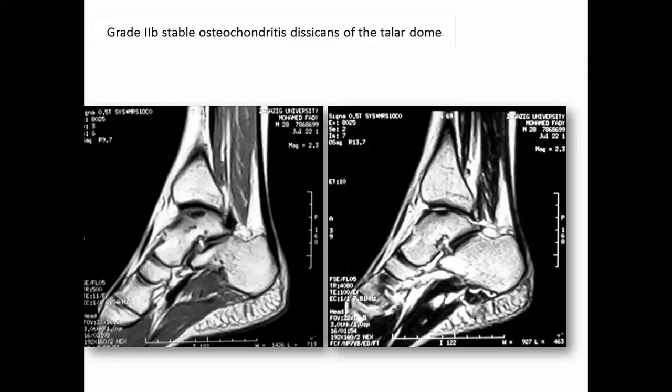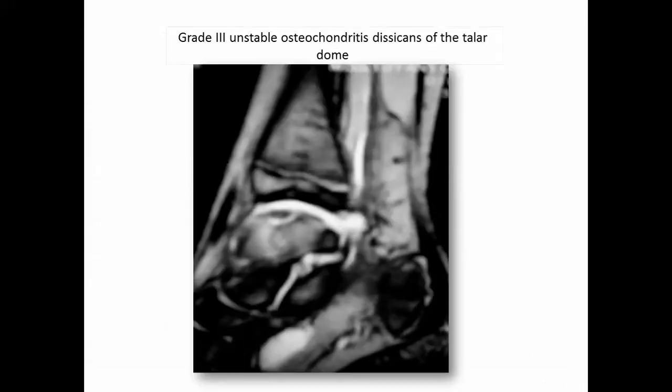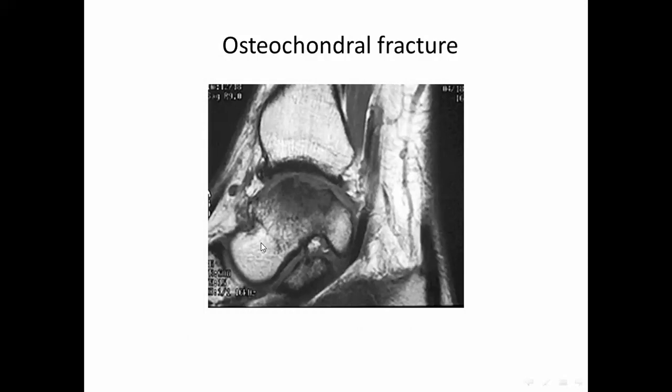Here, this one, it's not bone edema, it is incomplete separation. And here, this one, we have a separate but not displaced fragment here. Notice that the bone around is about normal, same as normal. But here the difference, there is something different.